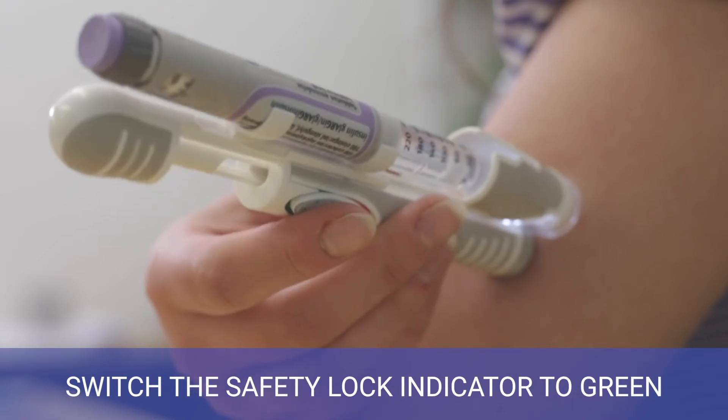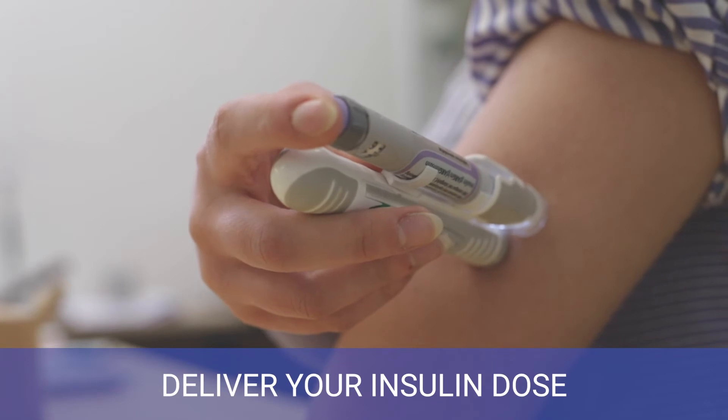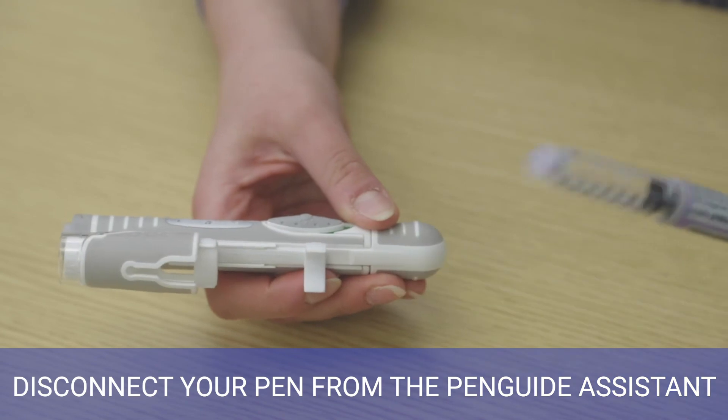Switch the safety lock indicator to green. Press the activation button. Deliver your insulin dose. Disconnect your pen from the Penguide Assistant.